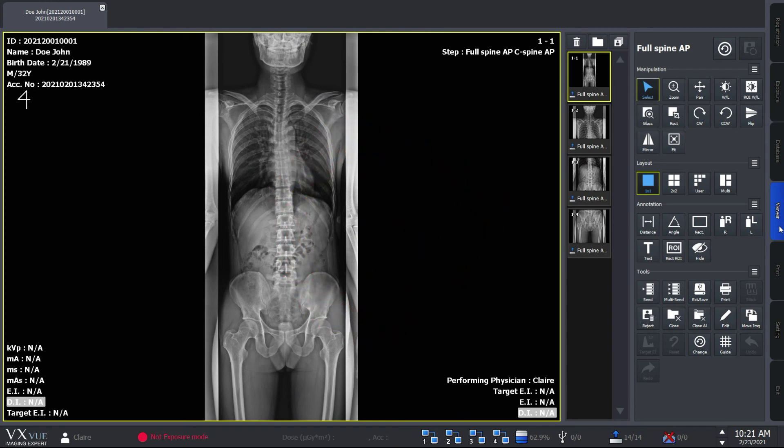Sometimes you may need to print the x-ray image. You can find the print button from the exposure, database, and viewer mode.